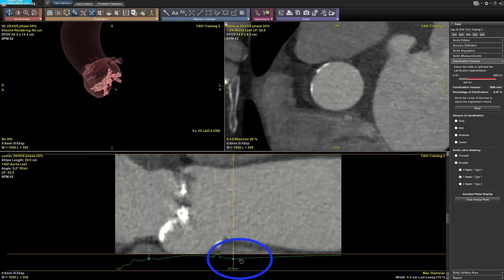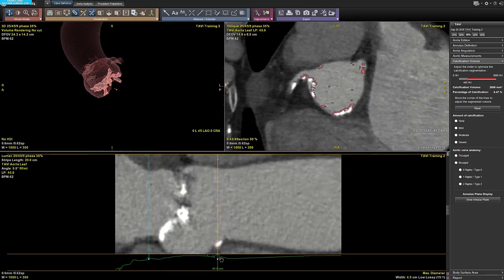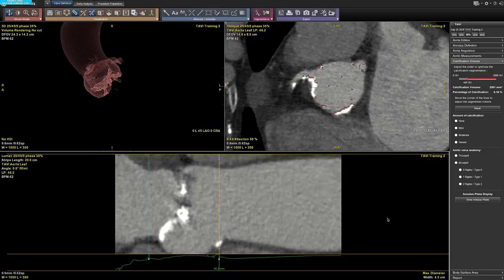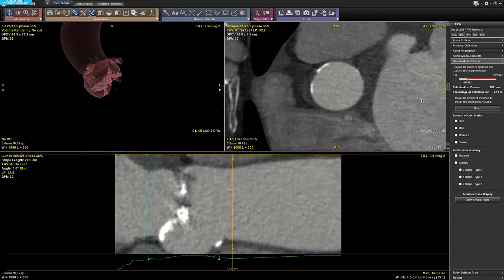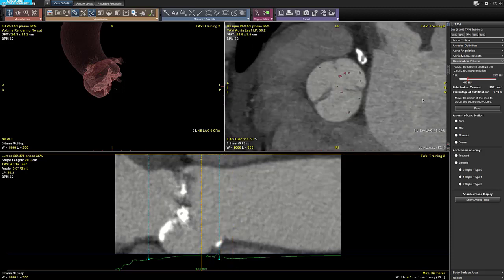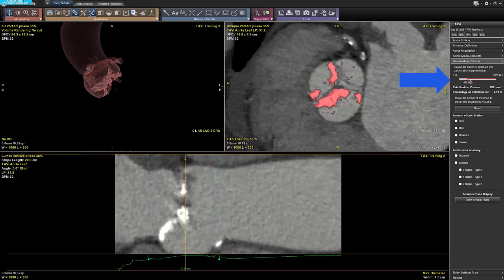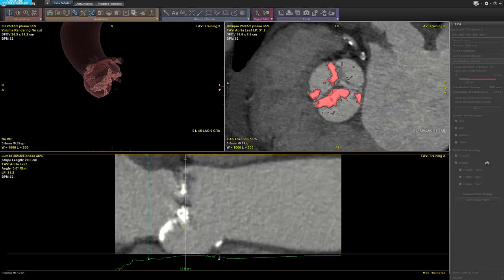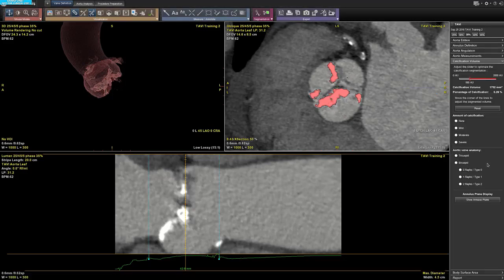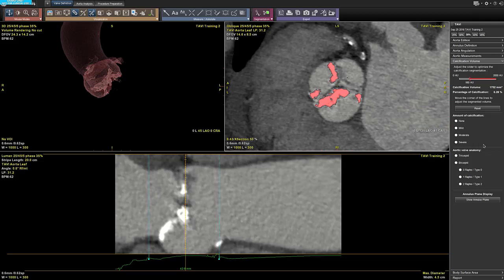You can edit the blue line by grabbing the extremity. You can also edit the threshold on the wizard panel by moving the slider. You can characterize the amount of calcification between none, mild, moderate and severe by clicking on the radio button — moderate in our example.